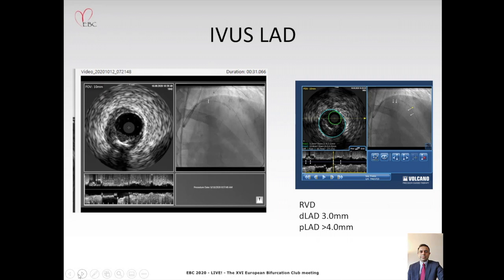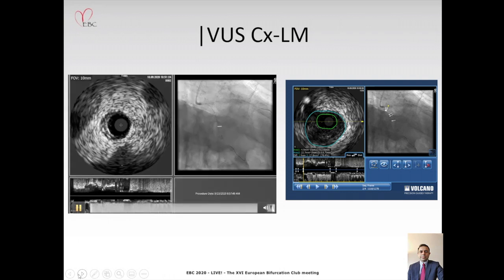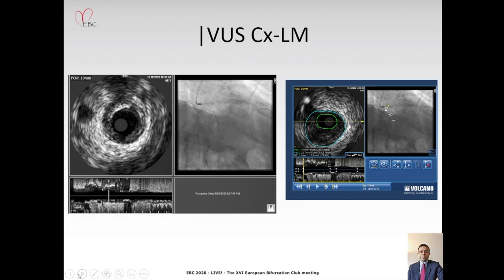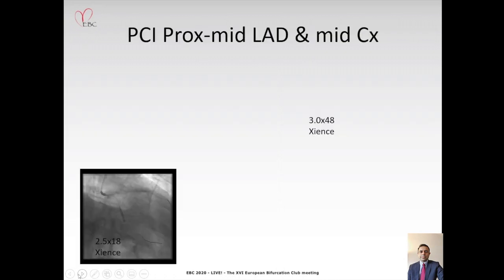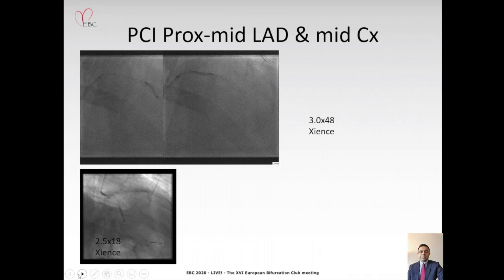So I'm not familiar with the Philips system, but clearly having co-registration using the wire as your marker for the vessel outline, is there anything you have to do differently for the co-registration setup than you would do ordinarily by using the angiogram, using the contrast to delineate the vessel? Yeah, so it's absolutely key to have a full study of the original angiogram.